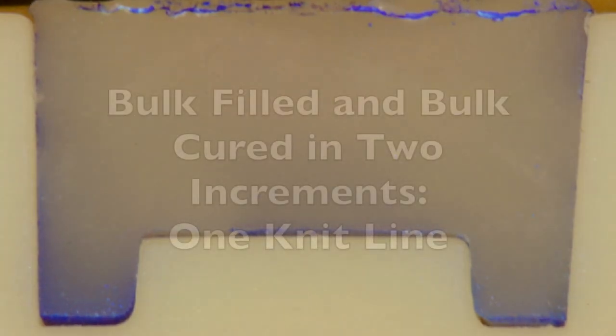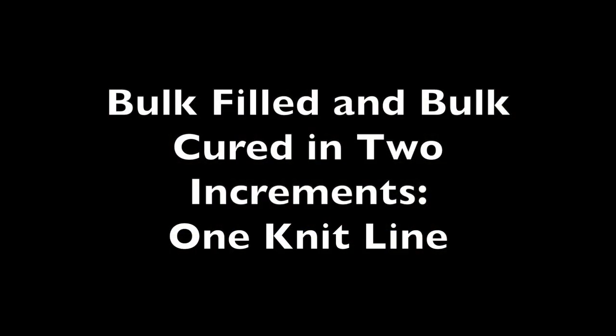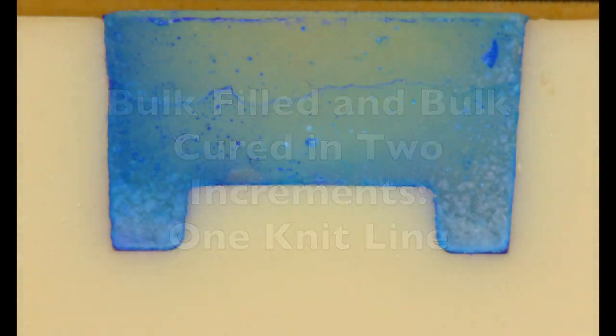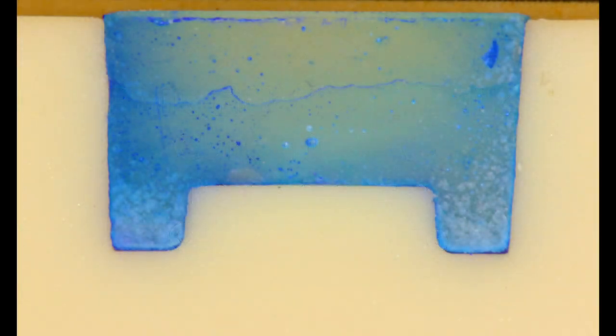Now I'd like to point out that just because the composite says it's a bulk fill material doesn't mean you can fill all cavities in just one increment. In order to obey the instructions for use, you may still have to fill the cavity in two increments, and this may introduce a knit line.